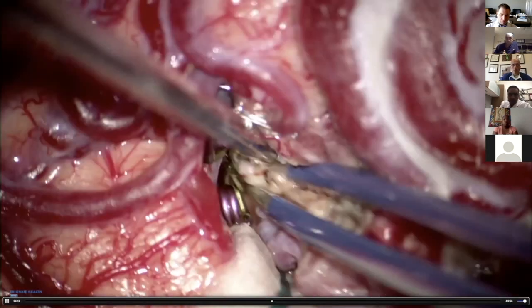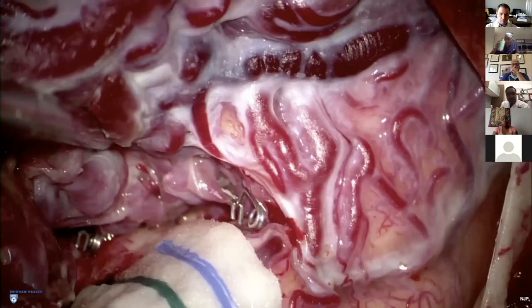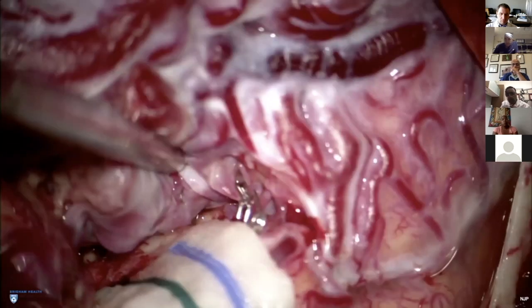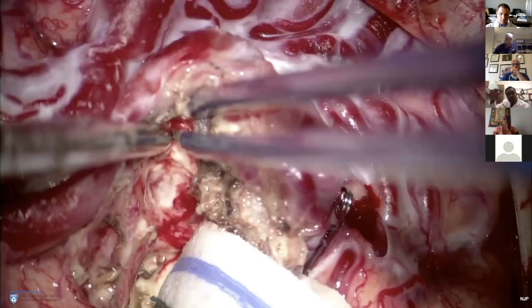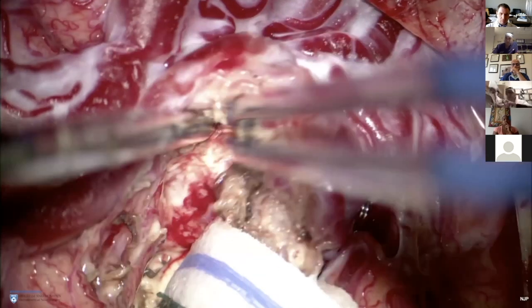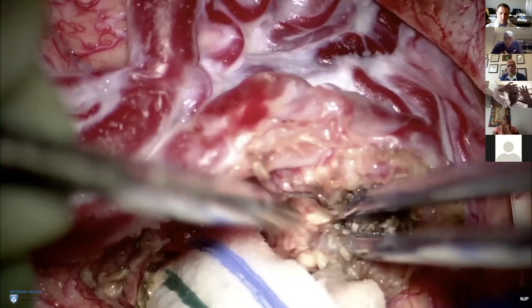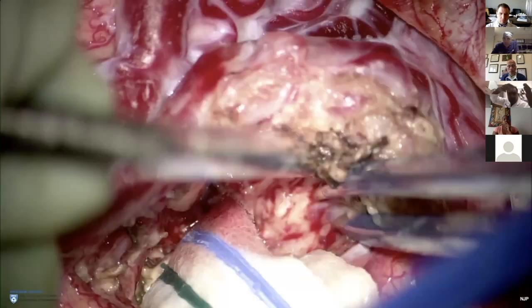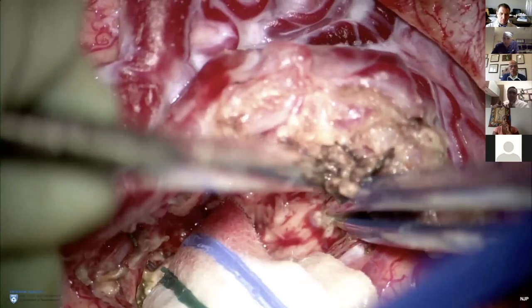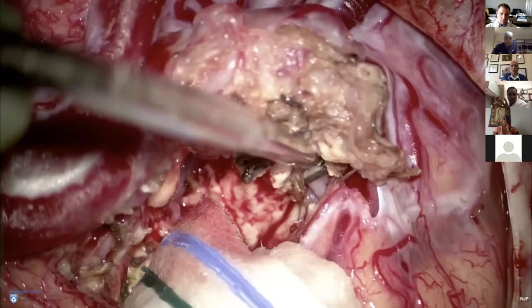Even the nidus, look, the way you dissect it is trying not to injure it. Just dissect that little bit of white matter around the vessels and sweep the AVM nidus back. Those loops of vein have done that because they're trying to preserve the kinetic energy of the blood. Now you take them back out of the white matter, bring them back to the AVM so it doesn't injure that part and doesn't cause a venous hypertension in the AVM when you're taking it out.